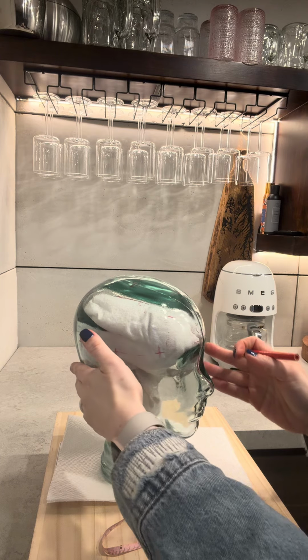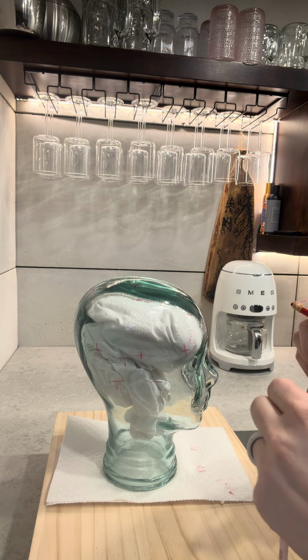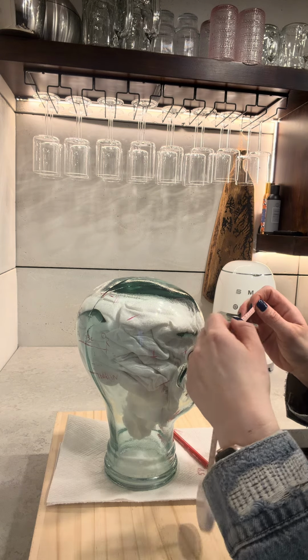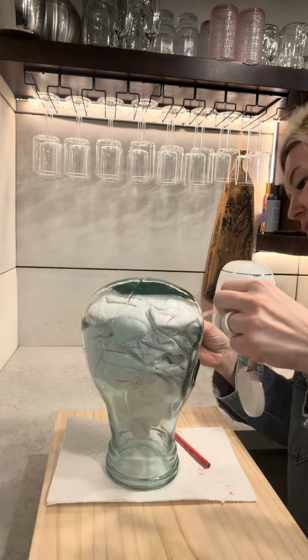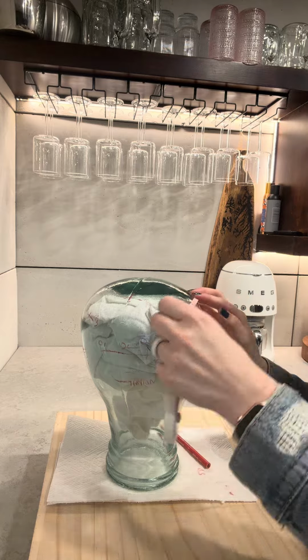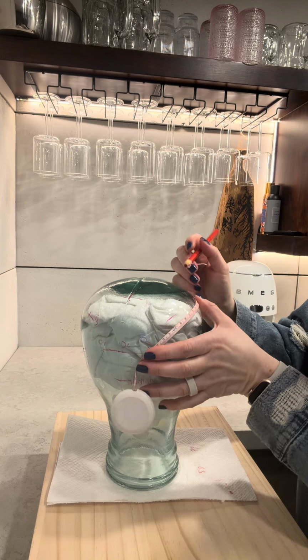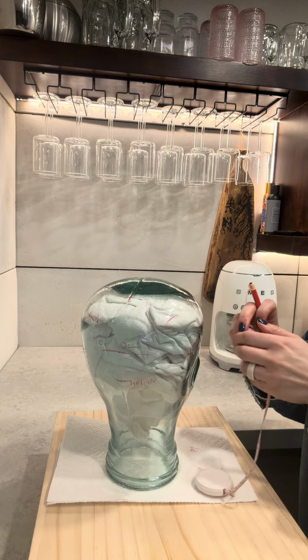and the same thing on the opposite side, on the right side, which is going to be right parasagittal from Fp2 through C4 to O2. Okay.